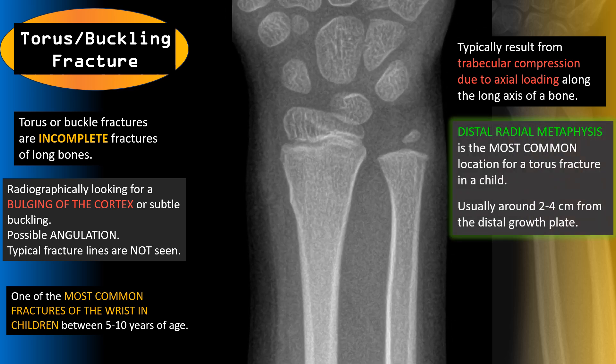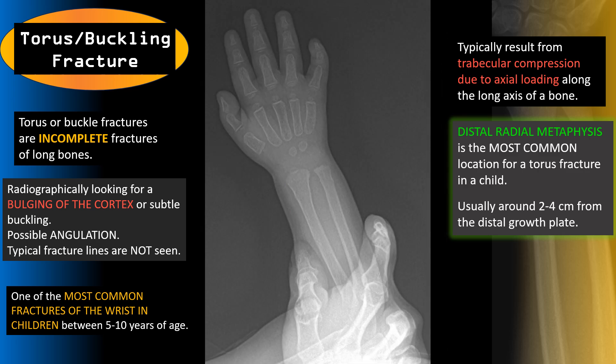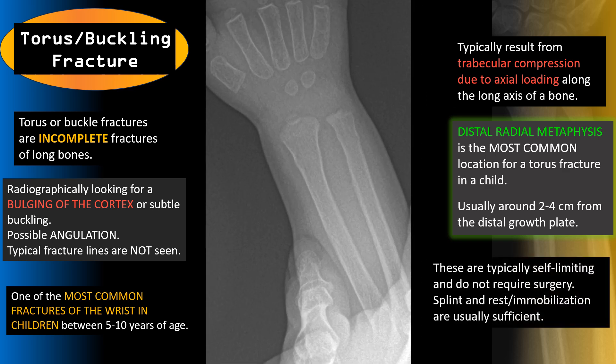These injuries result from trabecular compression due to axial loading along the long axis of the bone. The distal radial metaphysis is the most common location, usually around two to four centimeters from the distal growth plate. Here we can see a small torus or buckling fracture at the medial aspect of the distal radius. These types of fractures are usually self-limiting and do not require surgery — splint, rest, and immobilization are usually sufficient.